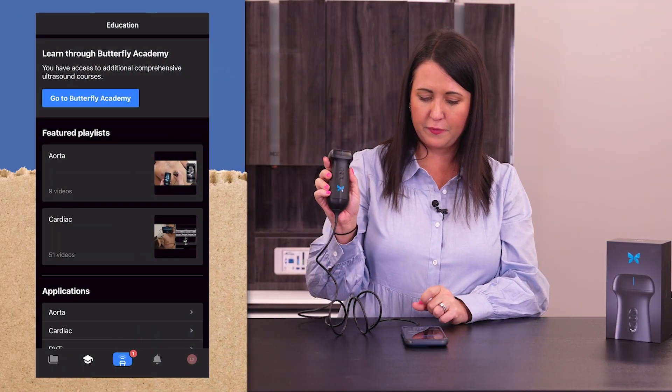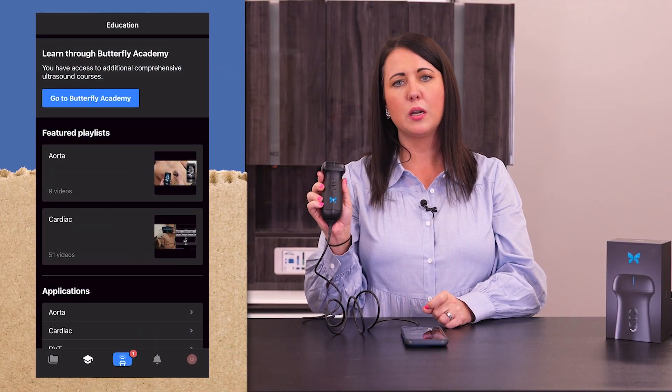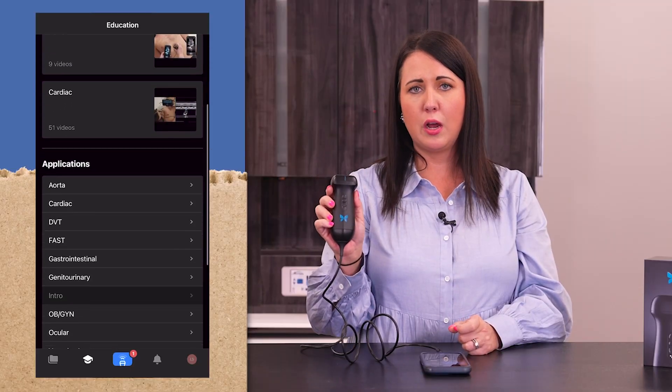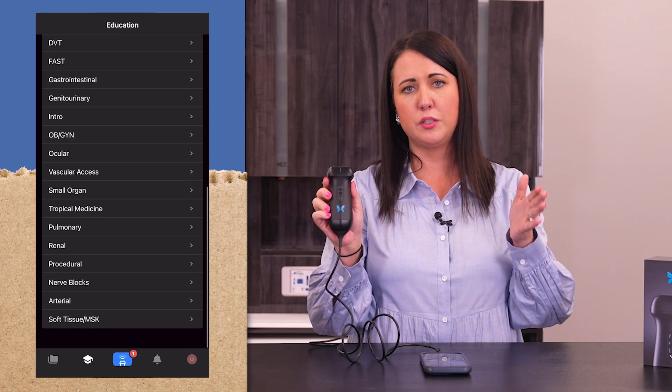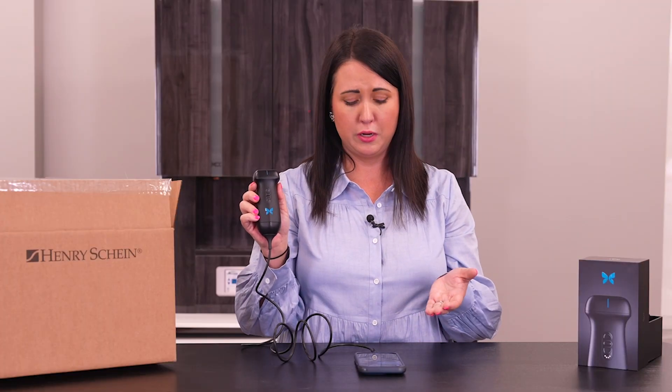Here is a really nice feature — the education part. Butterfly does a fantastic job with their education. When you're trying to learn a new thing that you're going to be scanning, a new part of the body, they do a very good job of running you through videos of exactly how to do those types of scans. That's huge. So as you're jumping off into handheld ultrasound, this is a great way because you have access to all of their education videos.